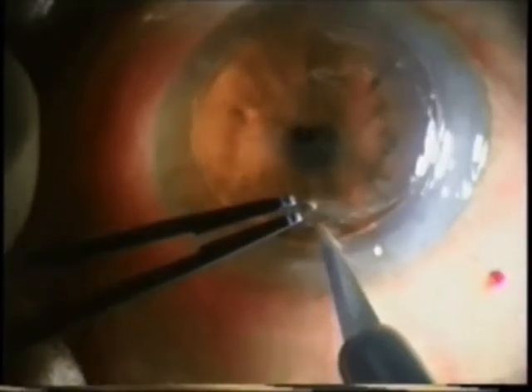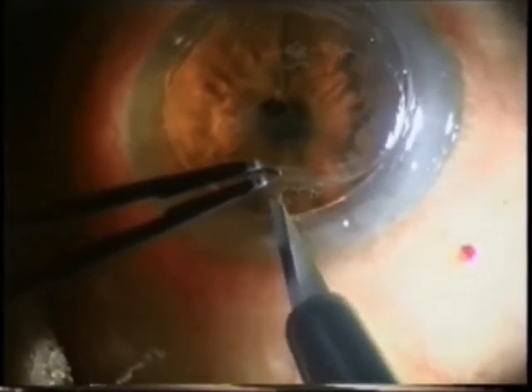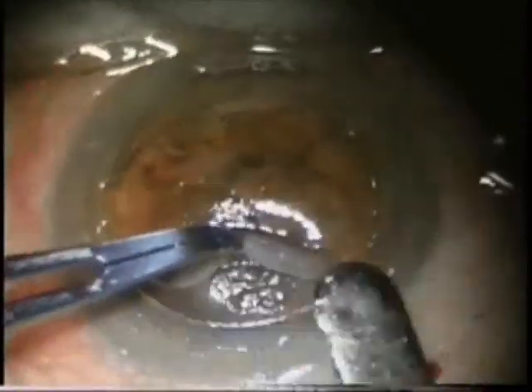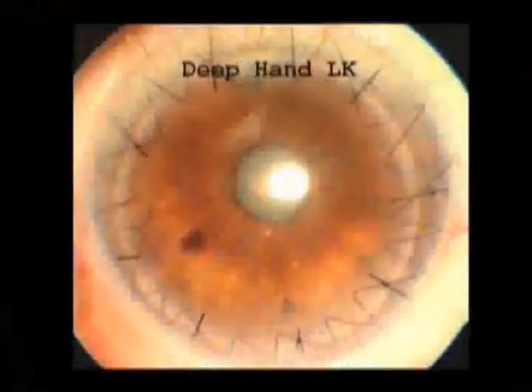In cases of deeper scars and higher irregularities, one can use hand lamellar techniques to go down to the layer we wish and separate that damaged lamellar of the cornea. Once again, a similar hand lamellar technique on the donor eye, going deeper to create a thicker donor tissue for future laser surgery, and suture this to the patient's eye.